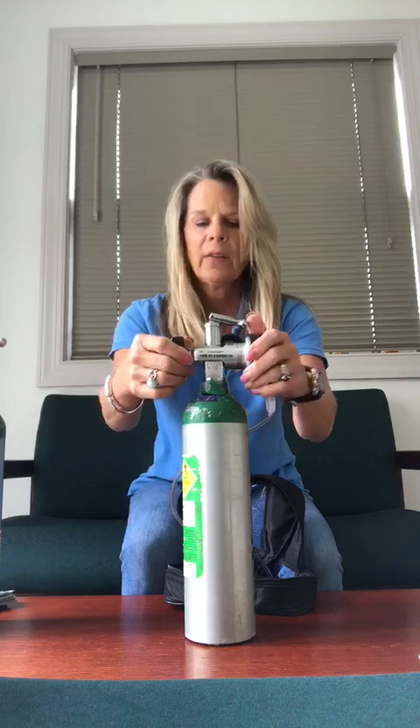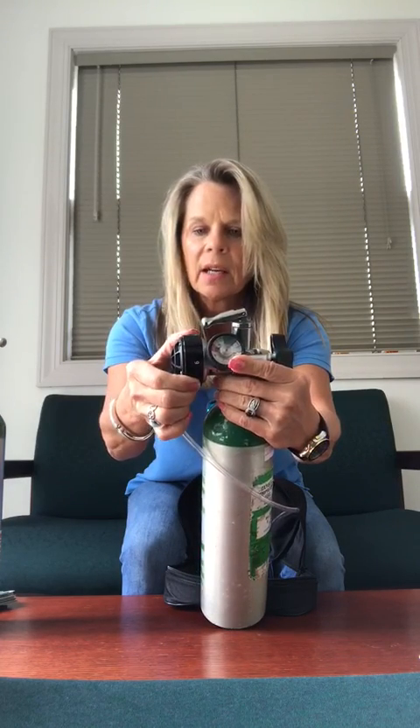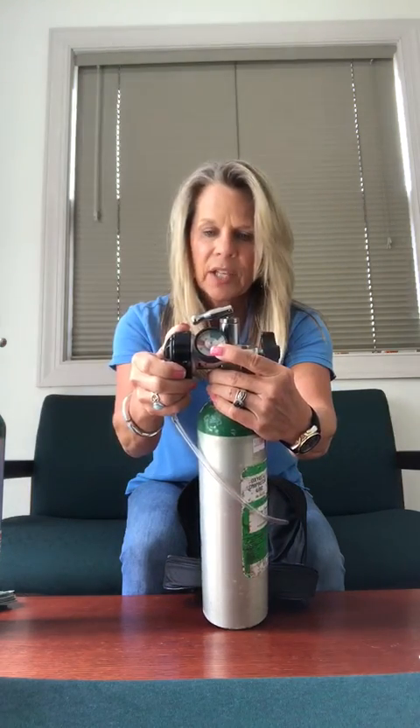If you have pressure still in the regulator, you might need to drain it. Draining it would be to turn this dial to continuous flow. That's going to drain the pressure out of the regulator and put the needle on zero. You need it on zero to change your tank.